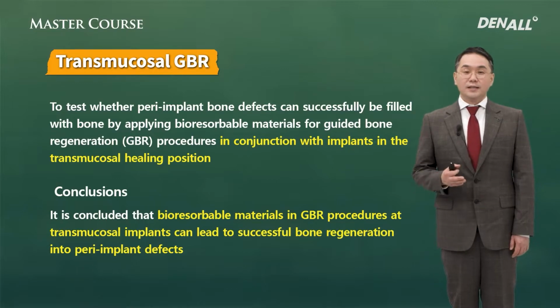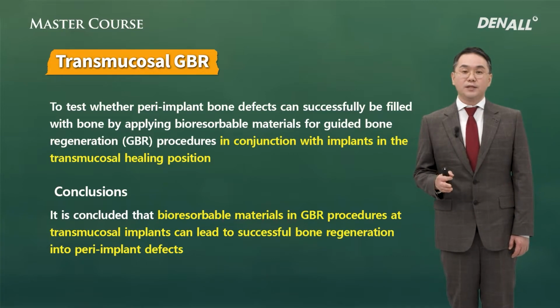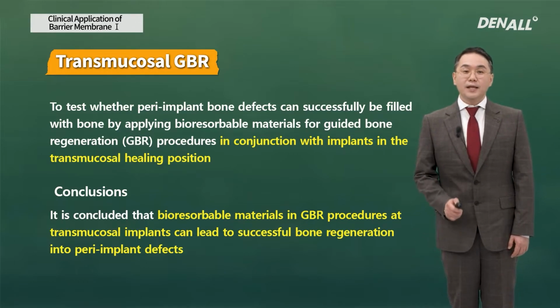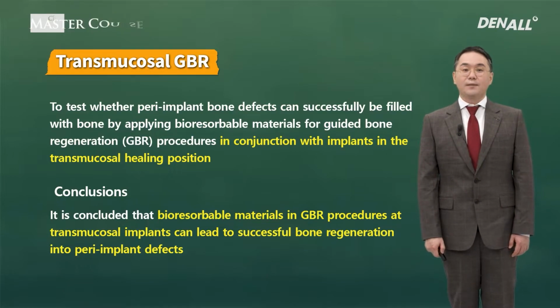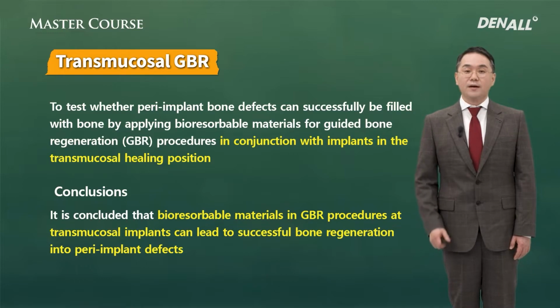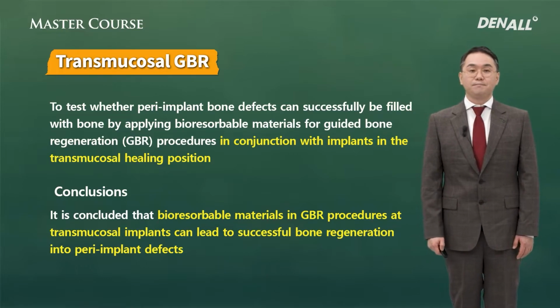Of course, it is different from natural tooth. There's no structure like cementum, so collagen fiber cannot fill the gap between the healing abutment or abutment. But hemidesmosome mechanism makes the mucosal sealing occur to a certain degree between the marginal gingiva and the healing abutment or abutment. If we can get enough mucosal sealing, bone regeneration can be ensured.